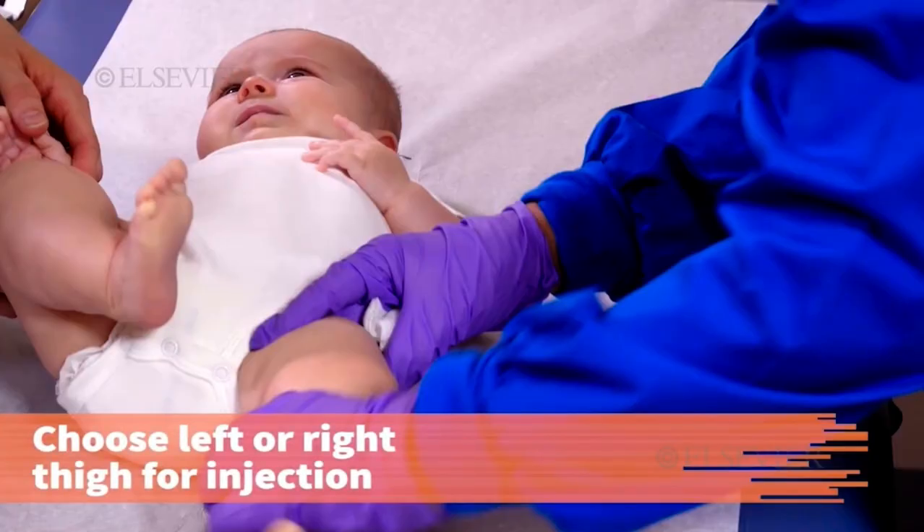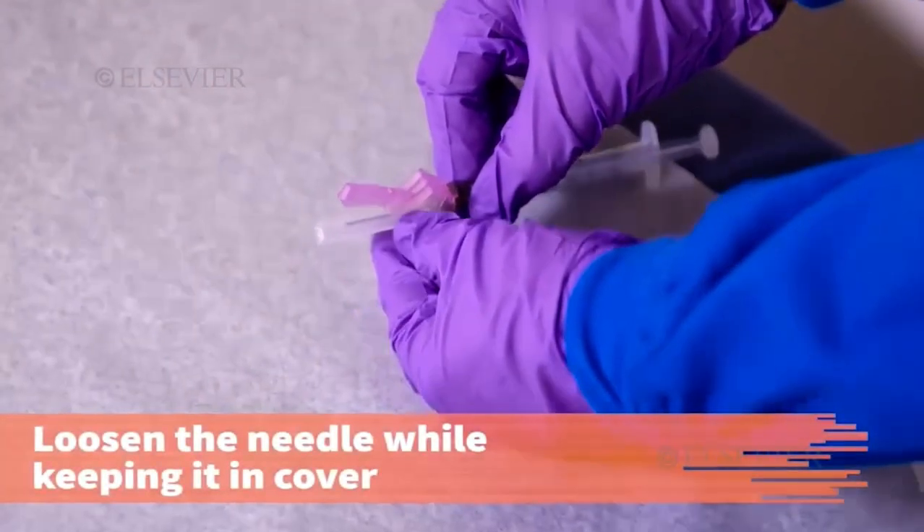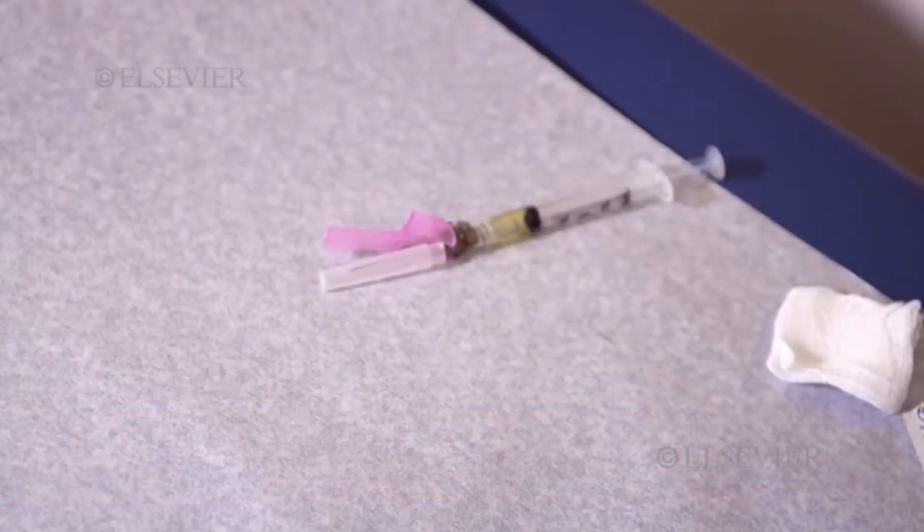Choose the right or left thigh for injection. Open alcohol wipes so that they can be grasped with one hand. Loosen the needle cover while keeping the needle within the cover, maintaining the sterility of the unit.